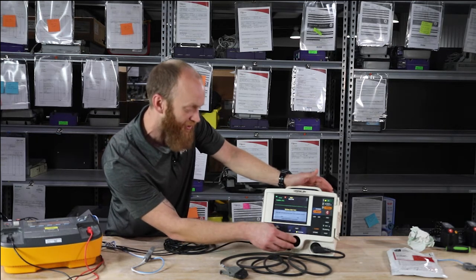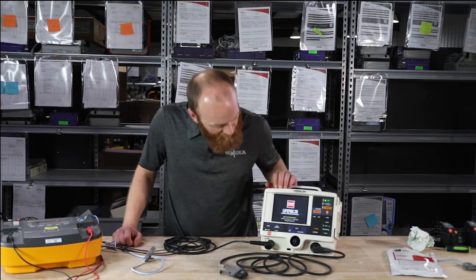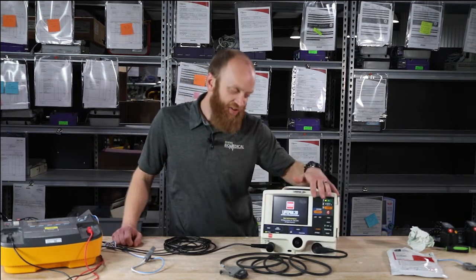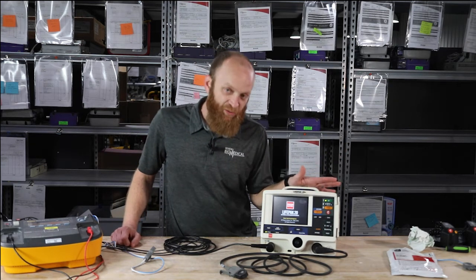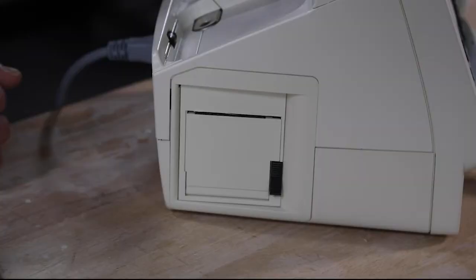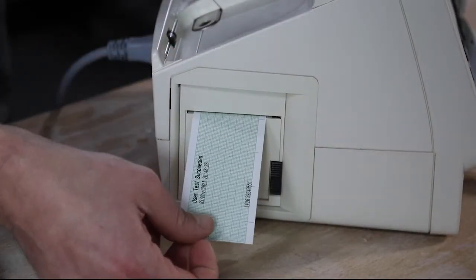It's letting me know it's leaving monitoring and is going to run a user test — running through basics and communications, then internally charging and discharging. When the user test is finished, it will power off and print a strip with the time and date, which you can save for your records.